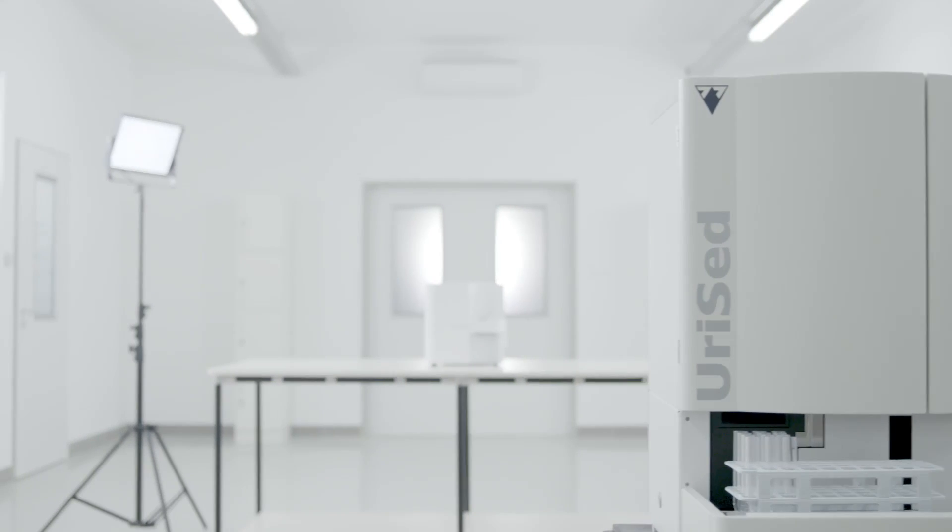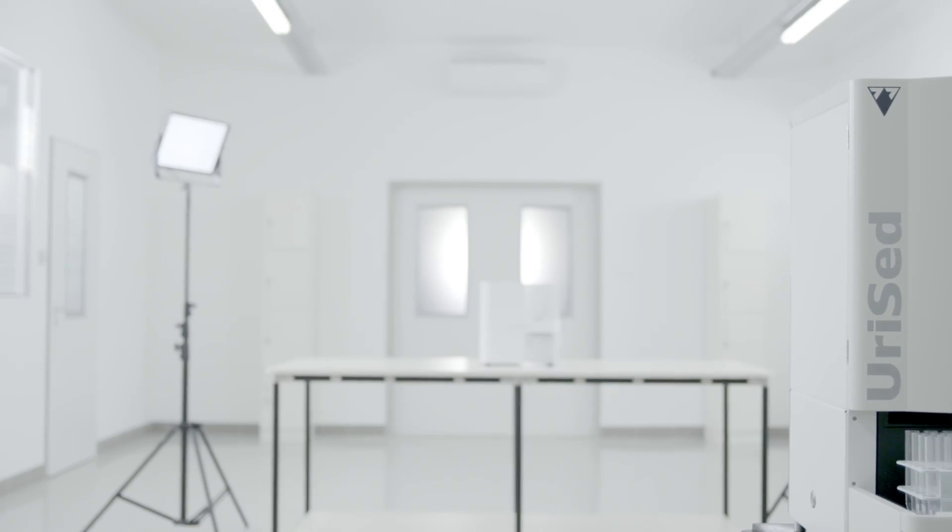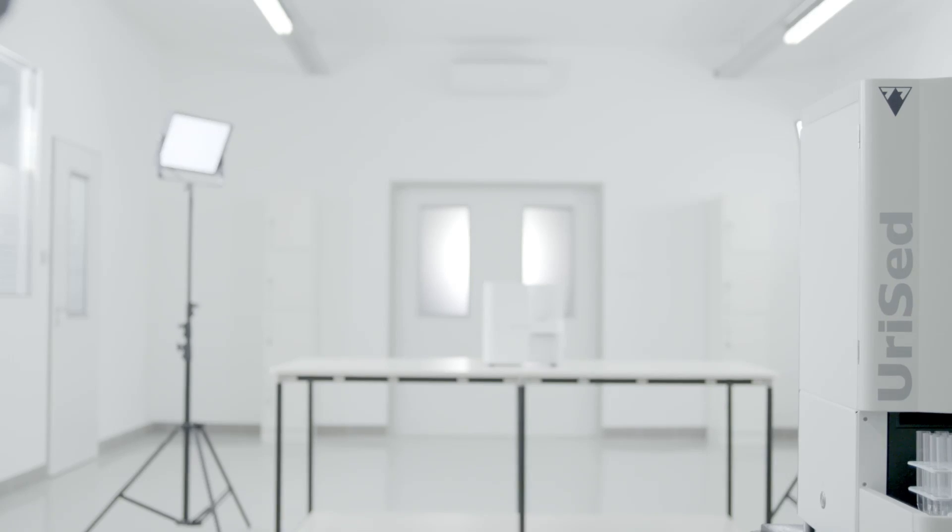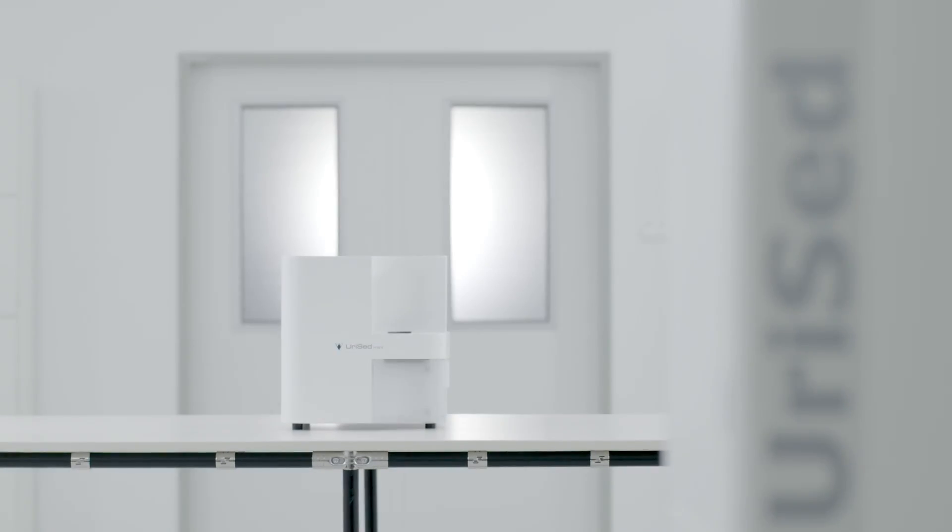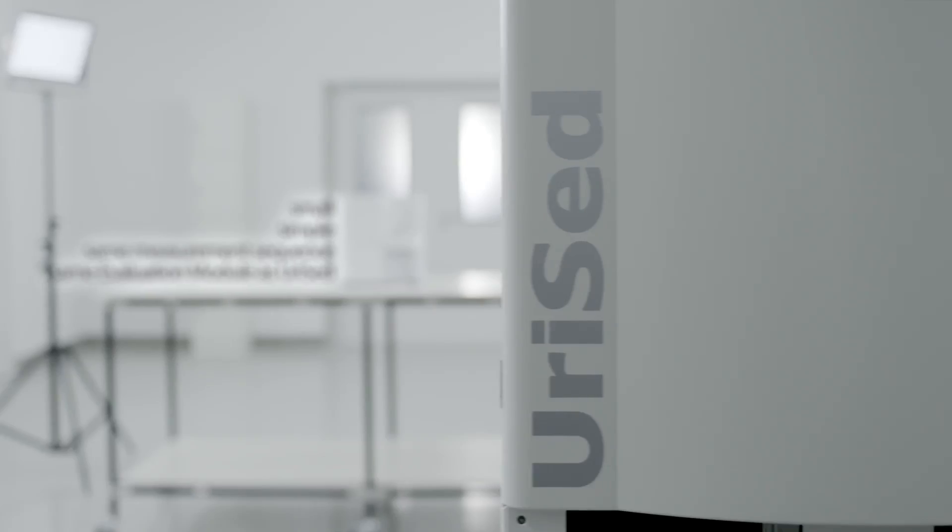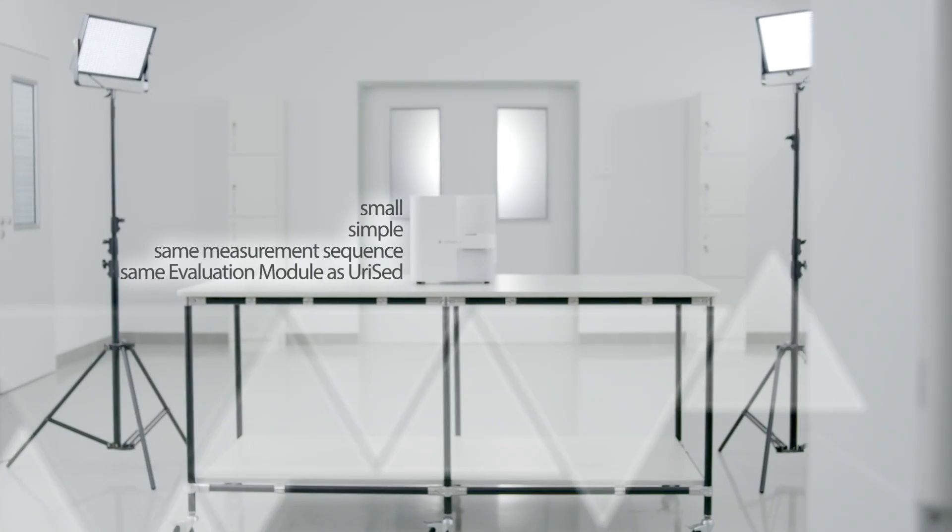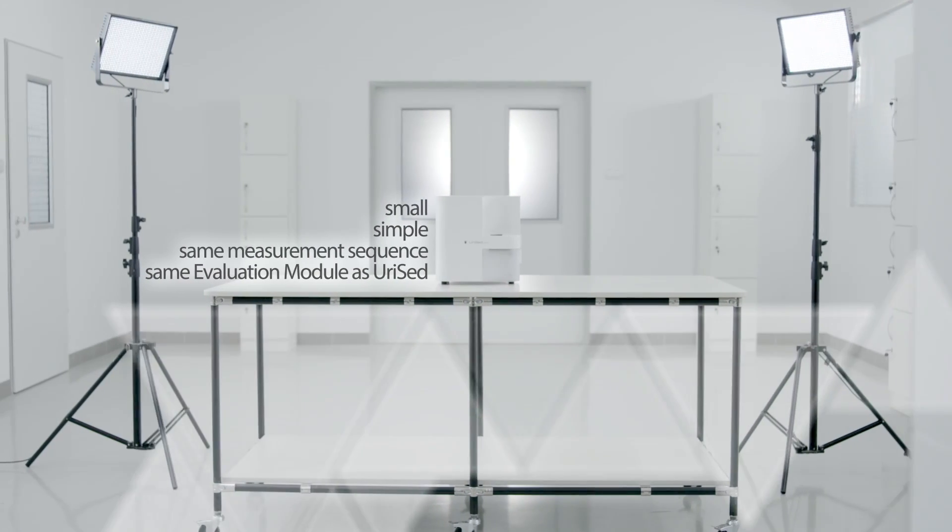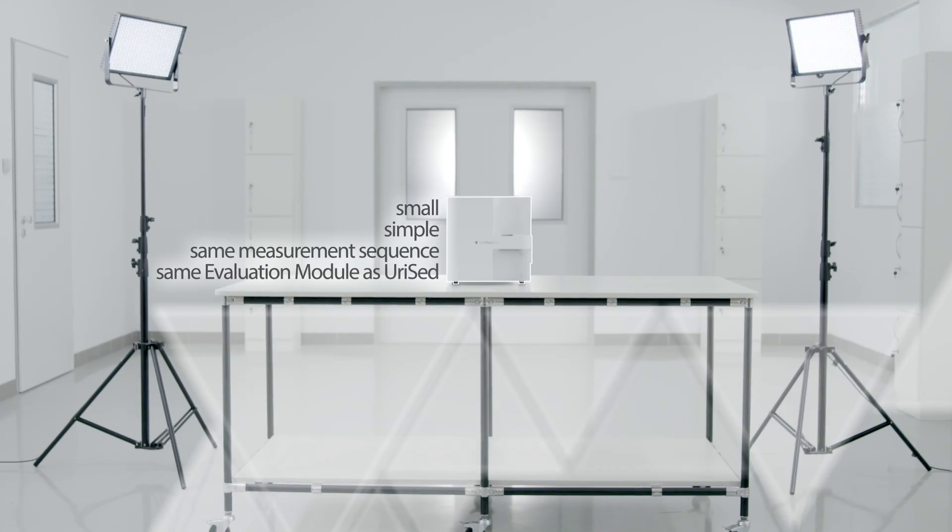URISED Mini is a new product category in urine sediment analysis with its semi-automated workflow. URISED Mini is small and simple, but uses many of the same hardware and software solutions as URISED.